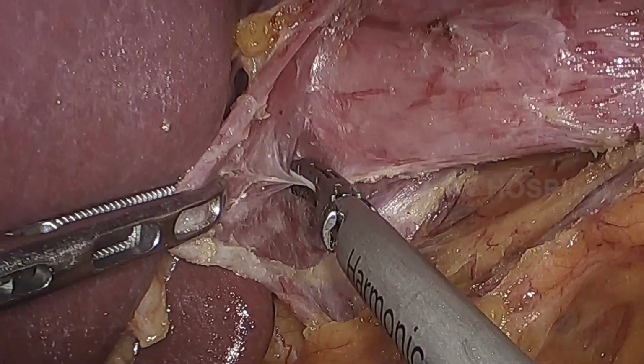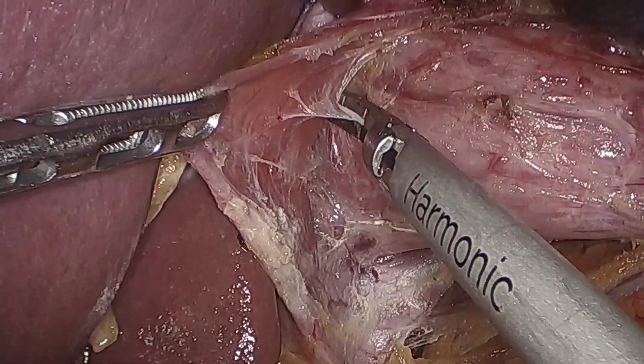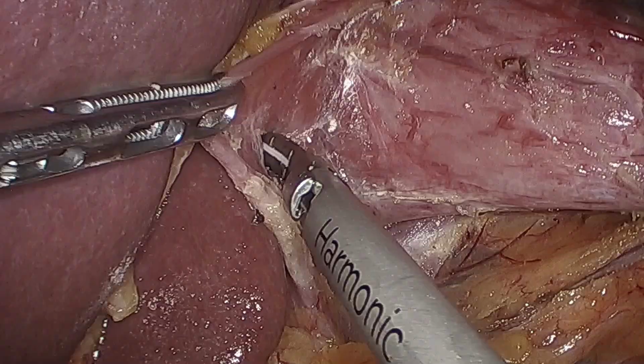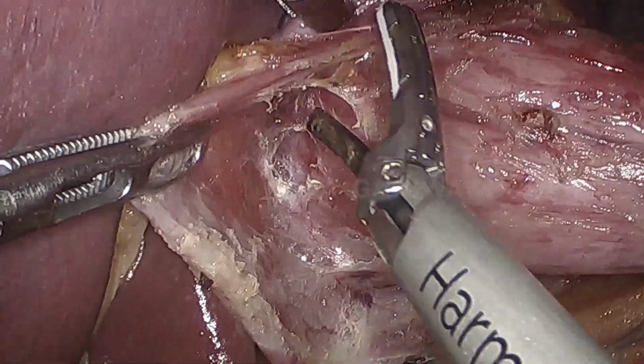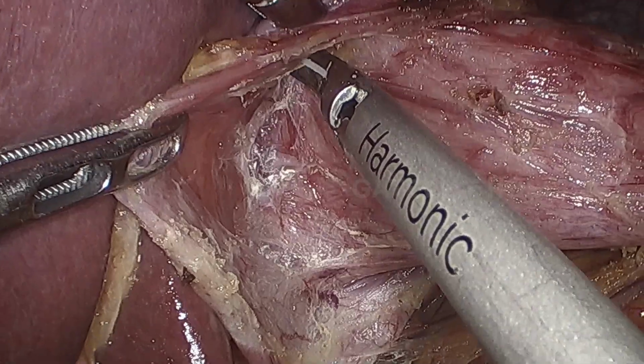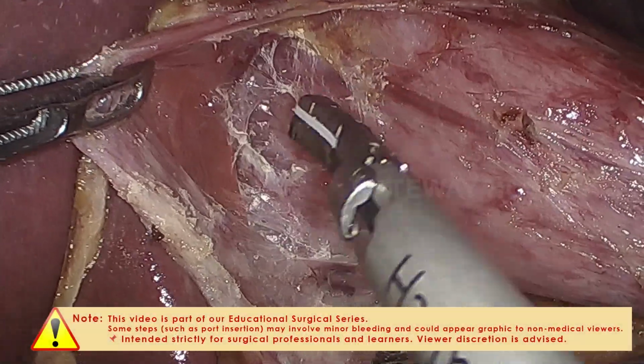And in chronic achalasia, there will be a fibrosis between the esophagus and the periesophageal tissue. So all this fibrous attachment needs to be lysed so that you will get good intra-abdominal esophageal length, and we can do myotomy comfortably.